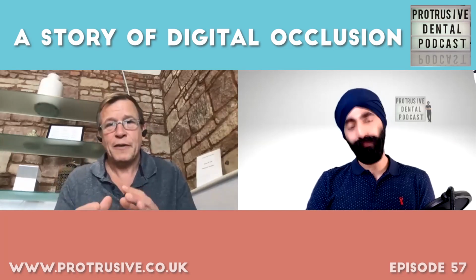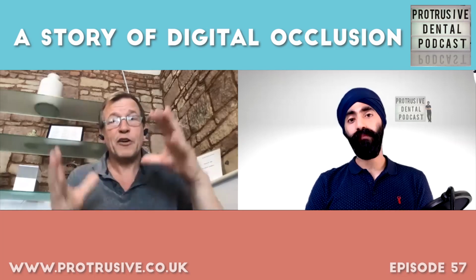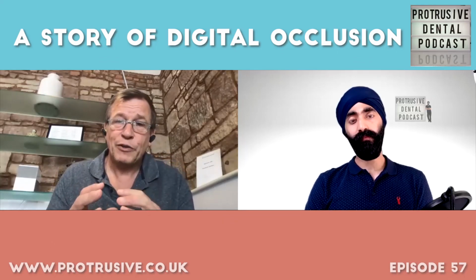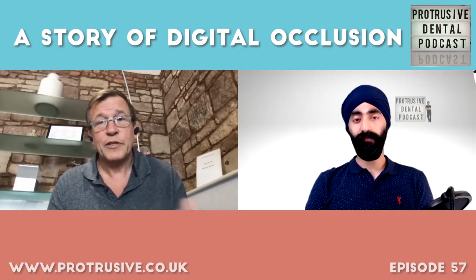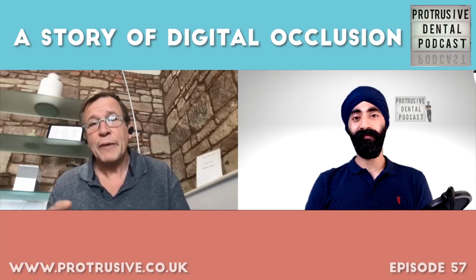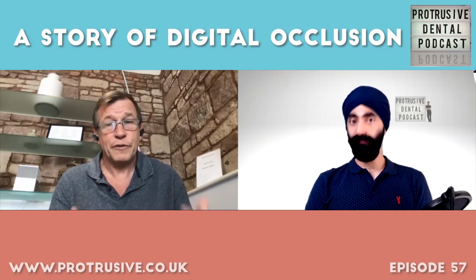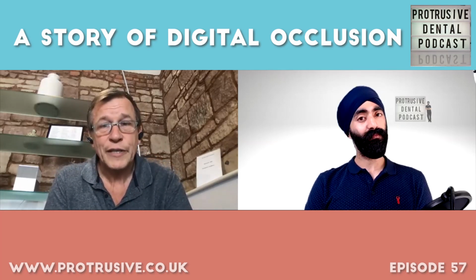Yeah. So no matter how little we're doing, we're looking to go, if I just do that tooth, is it going to be okay? And if it's okay, great, let's just do that. But I want to be able to look at that. And the traditional way is you would gather records. And then we'd have photographs, we would have mounted models, and then we'd be able to look at that and work out diagnostics, and then work out a treatment plan about where these teeth needed to go to fulfill the goals that we'd set out to achieve. So then, can we start to do those things digitally?